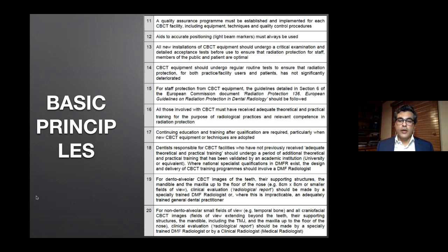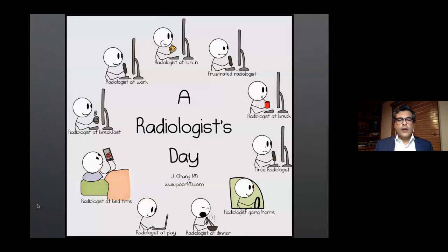So essentially what they are recommending is that anything beyond a small field of view or a small group of teeth should be read by a dental and maxillofacial radiologist, as availability permits. And not all places have dental and maxillofacial radiologists available. In that case, have a medical radiologist perhaps create the report for you. Okay, this is how a typical radiologist will look, and it represents that in a very lighthearted manner.